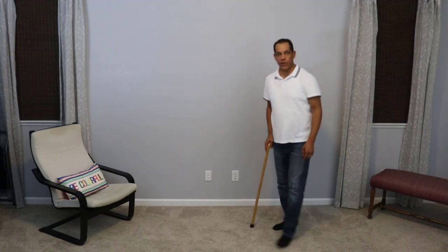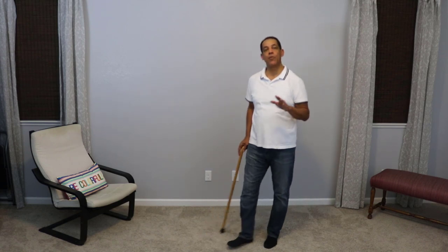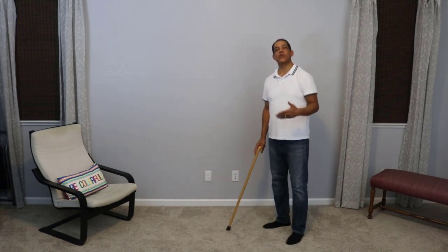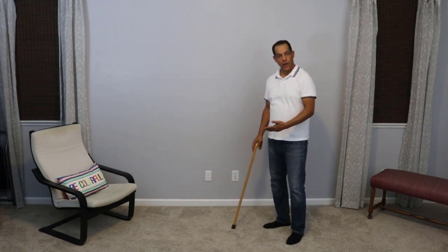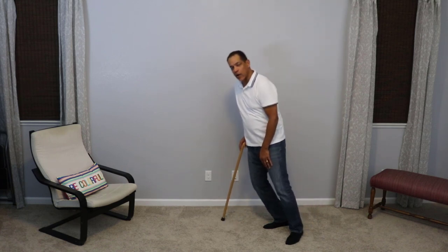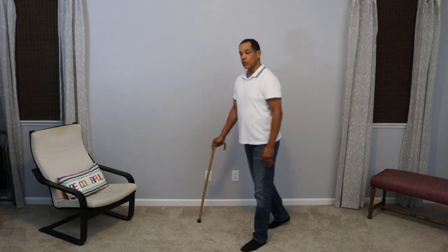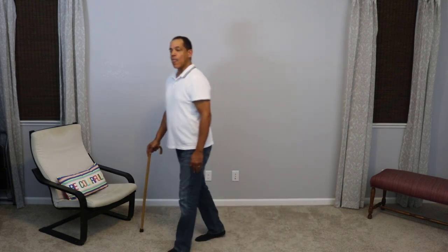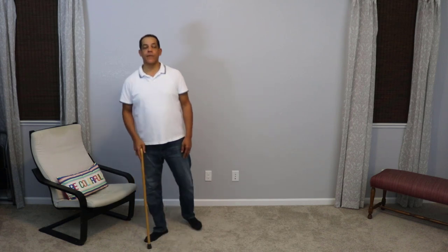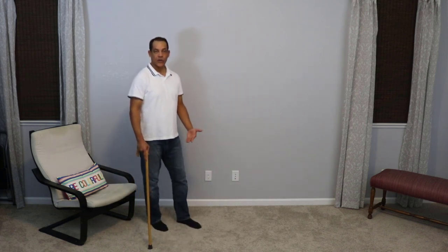When that foot hits the ground, I want to have some support on the cane. A cane is not meant to hold up your body weight. The cane is basically meant to give you a little bit more stability and balance so that you're able to continually walk. You do want to lean on it a little bit, but you don't want to put all of your body weight on it. You want to basically support your weight with your legs.